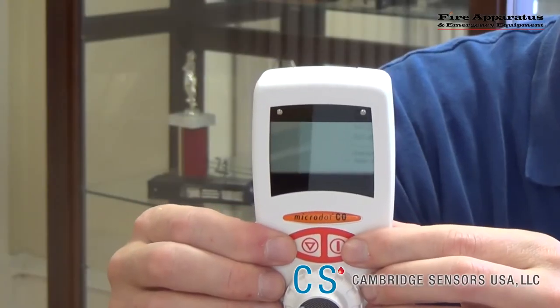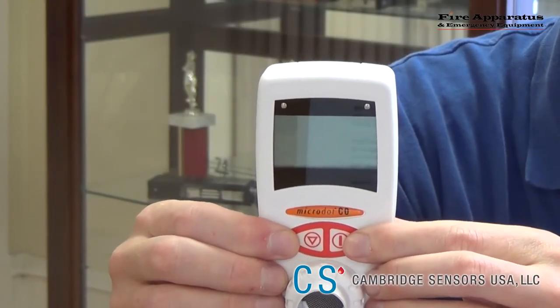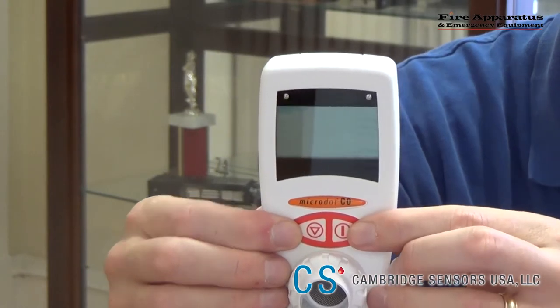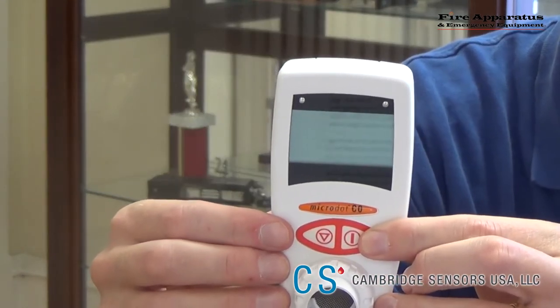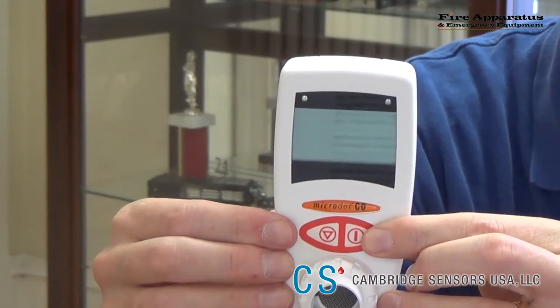There are two buttons on the face of the Micro.CO. The right button turns the unit on and off. The left button toggles between percent carboxyhemoglobin in the blood and parts per million of CO in the lungs.